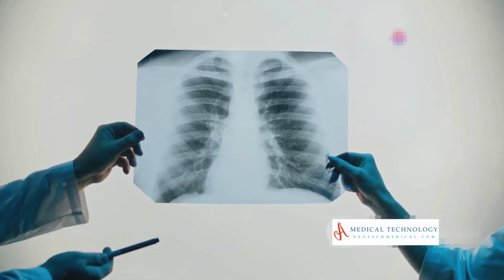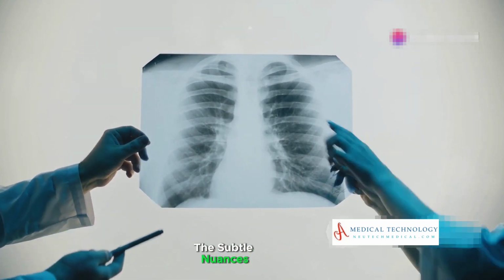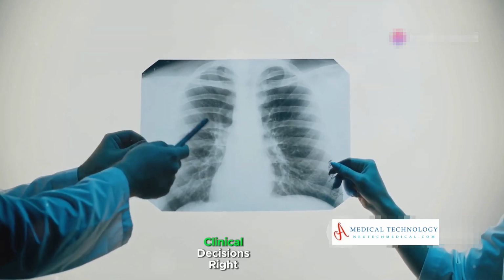Understanding the chest X-ray, therefore, is not just about spotting the obvious, but also about appreciating the subtle nuances that could be the key to unlocking vital clinical decisions.